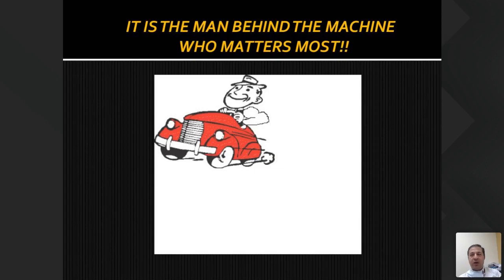You've not seen it. You've not really seen the parasite. You're only looking at those cells which are unlysed red blood cells, or maybe a hemozoin pigment which is there in, say, the WBCs, etc., from where you're picking it up. Now, unless you see the parasite on the smear, you cannot be sure that it's a parasite indeed. So therefore, our jobs will still remain. We will have to verify it on the smear and then give a value.